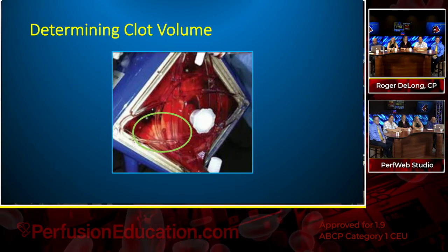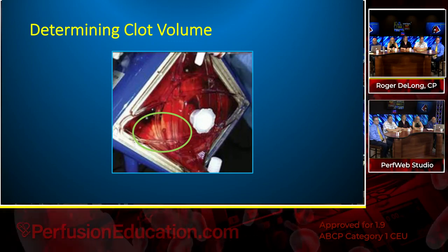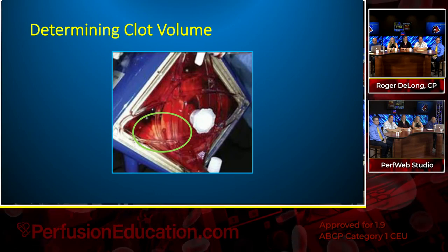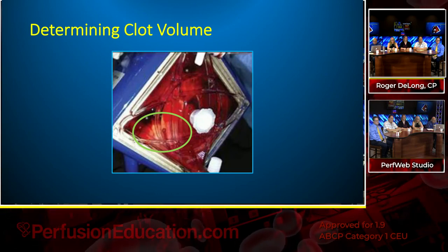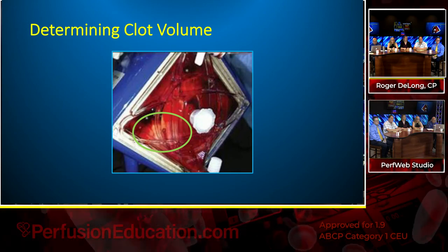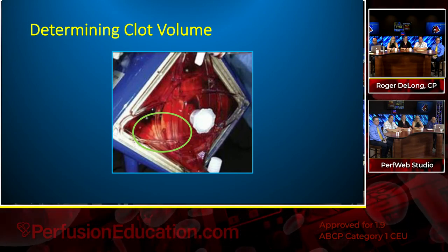Next slide. You can also see a small portion here with fairly wide open fibers. These act much like a leak in any system, and the pressures will be deceptively lower. They won't rise if you even have a small field of open fibers.